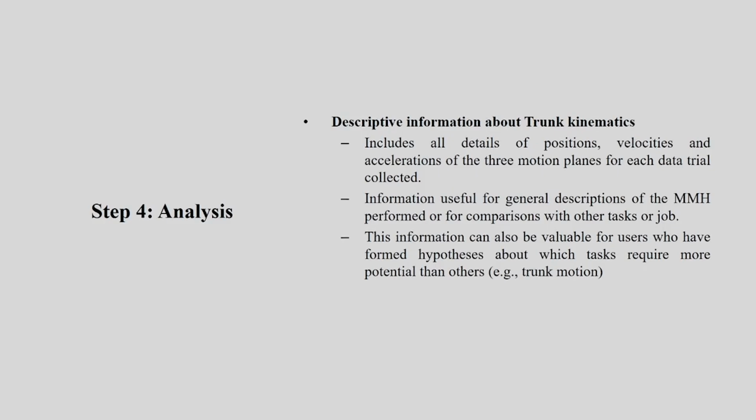This information is useful for general description of the MMH performed or for comparison with other tasks or jobs. This information can also be valuable for users who have formed hypotheses about which task requires more potential than any others. Okay, that is done for the descriptive information about the trunk kinematics.